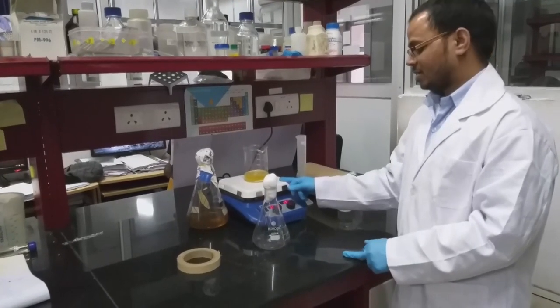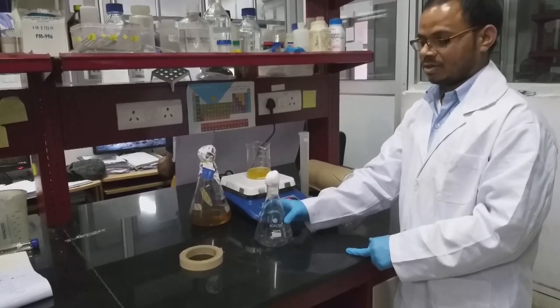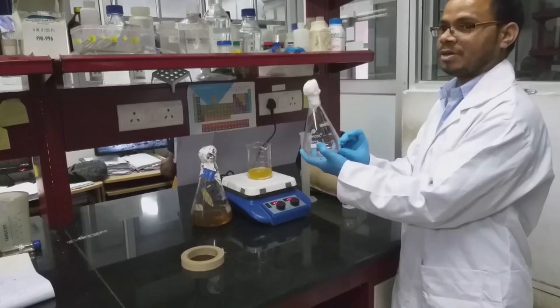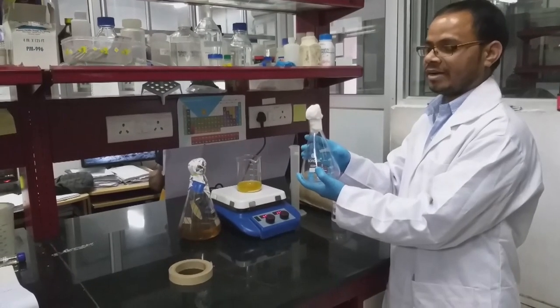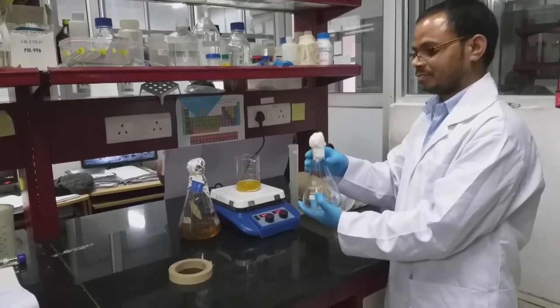Once the media dissolution is complete, we have to pour it into the flask. We pour up to 100 ml, so we use only one third of the flask. The remaining space is empty. This is used for aeration and also ensures proper autoclaving.